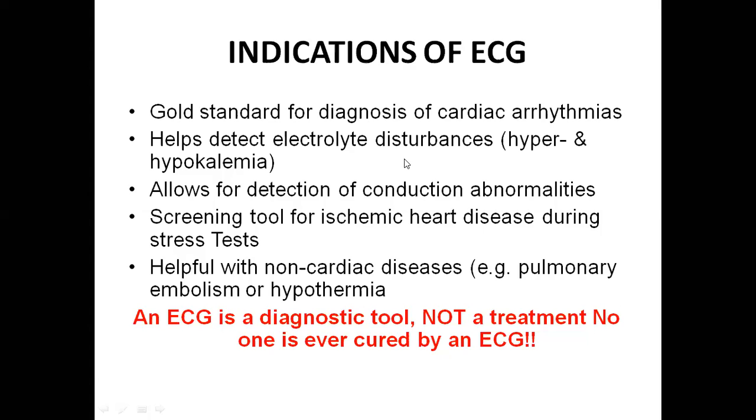The stress test is typically done on sportspersons when they are about to appear for a match, for any kind of sport competition. Prior to participation, they need to undergo this ECG test, because they have to certify that they are physically fit, their heart functions are absolutely normal.